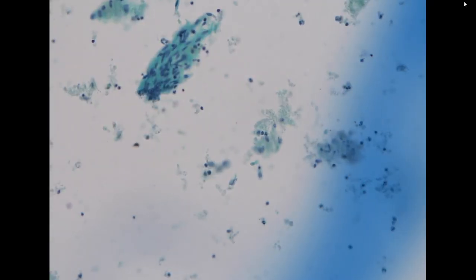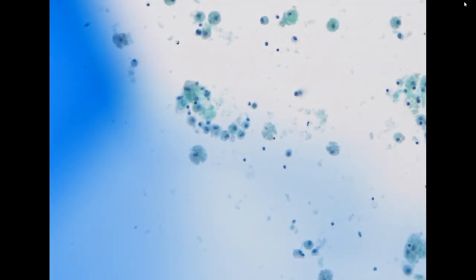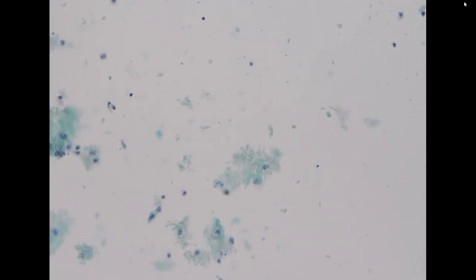In this situation, with cystic background and some atypical cells or indeterminate cells, it is also okay that we call it AUS. But because we have residual specimen and the cytotech did mark that we do have some residual that looks like a solid tissue fragment inside, in this situation we will usually do a cell block preparation from the residual specimen. So we will do a cell block, and then we will decide if we have some more elements for the diagnosis, or we will just call it AUS.